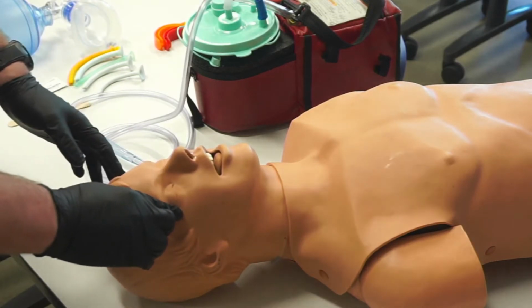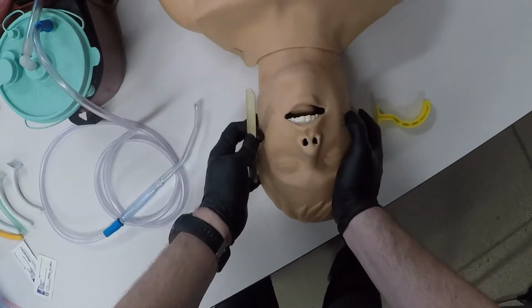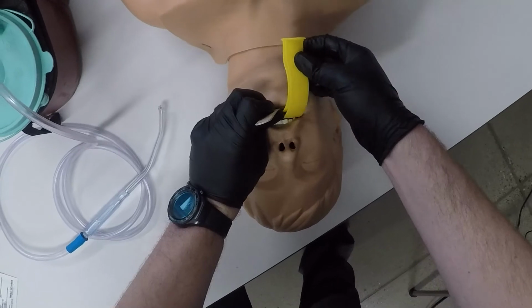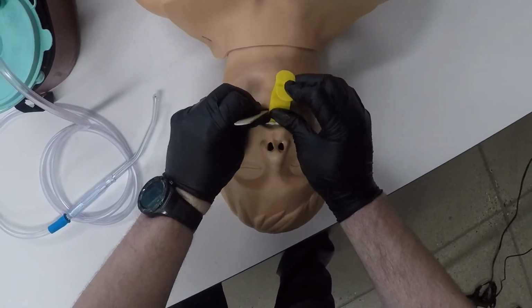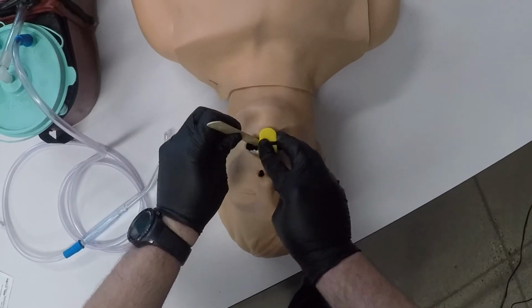There is no gag reflex present, so I'm going to take my tongue depressor, position my airway, and insert my OPA with a tongue depressor in the position of use. If I did not have a tongue depressor, I would insert it at a 90-degree angle and turn it around.